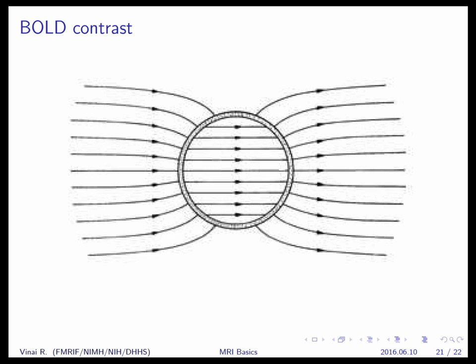Just in relation to that, because you were saying this background gradient obviously is what creates the T2 star image, but the background gradient also exists when you're taking a T1 or T2 image, so how is it that you're specifically targeting this in T2 star to get a different image? So we focus on the different types of tissue contrast because of how we time the different pulses in our MR sequences.